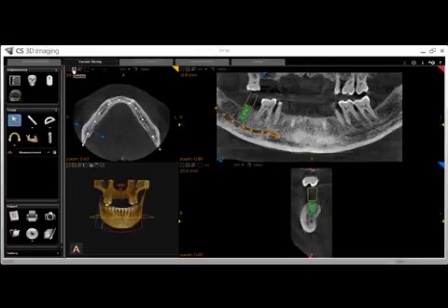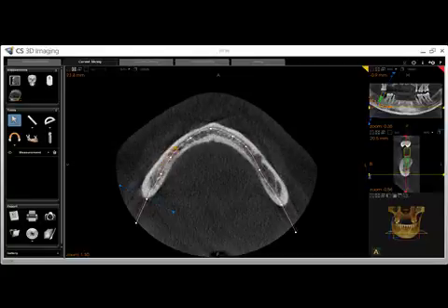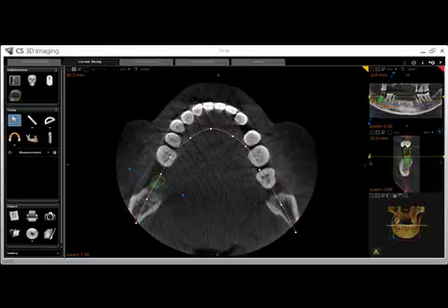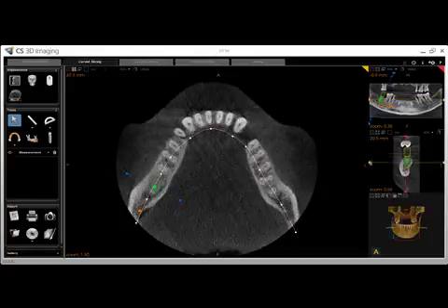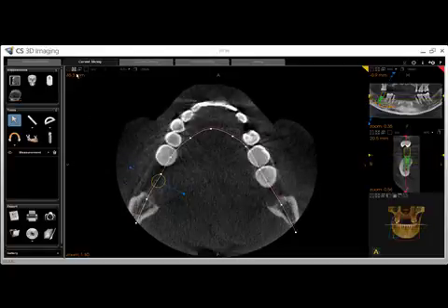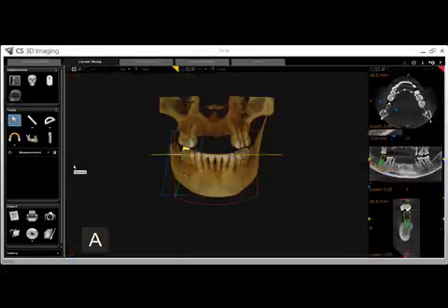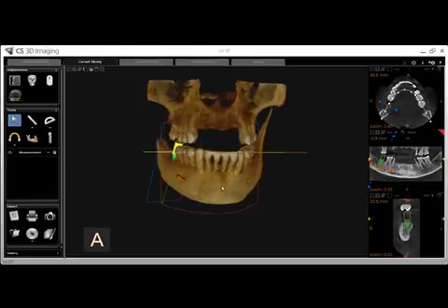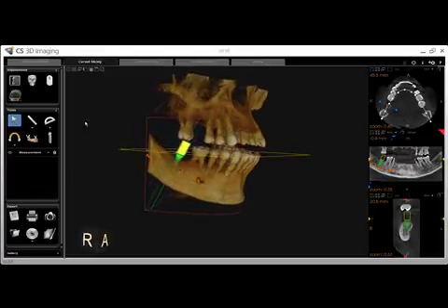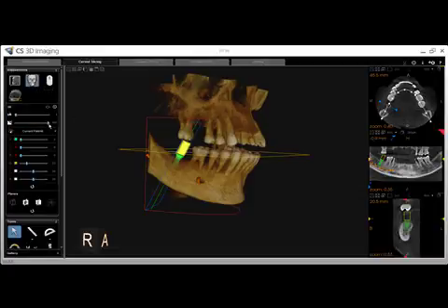To visualize buccal-lingual positioning, you may maximize the axial slicing, then use the yellow movement handle to move inferiorly and superiorly through the fixture. You can also bring the 3D rendering up to full screen, scroll the mouse to zoom, left-click and hold to rotate, and then under 3D adjustments, adjust the opacity to show your patient your proposed placement in bone and the relationship to the nerve.